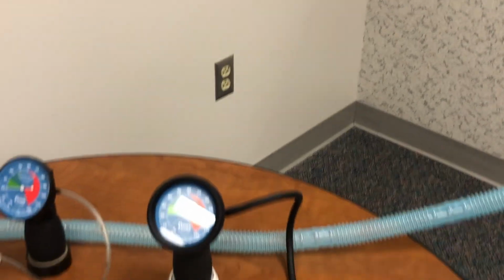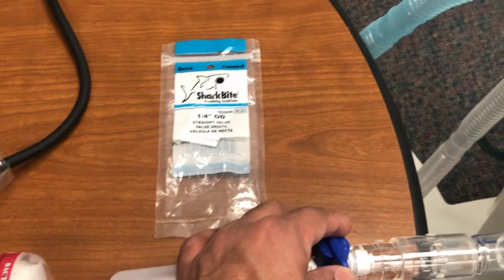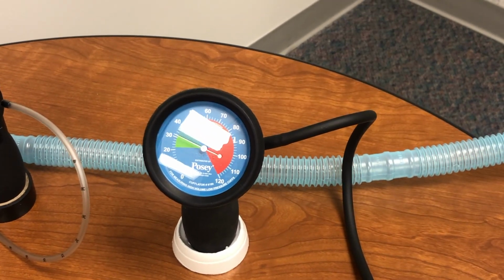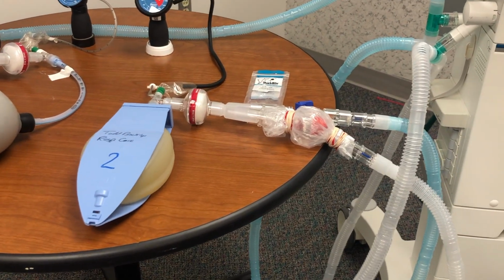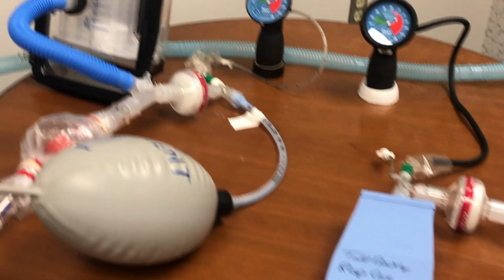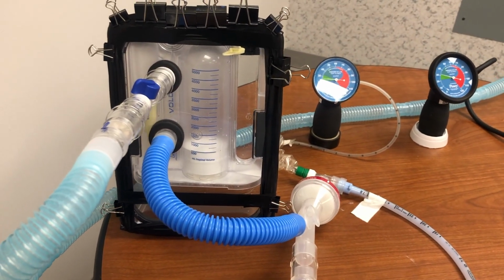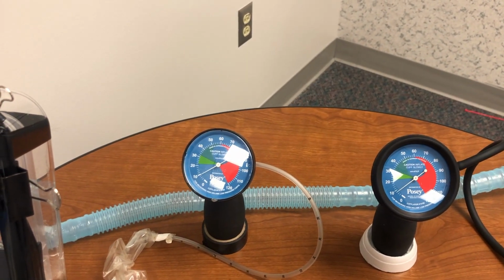Now, let's say this patient develops a leak or develops a pneumothorax. So I'm going to open it fully. So his pressures have changed dramatically, 30 to 40. Now let's see here, the volume has changed. This patient suddenly has either developed a leak or his lungs have become very compliant. Let's see what happened to our other patient, how much the volume changed. None at all. How much did the pressure change? Very similar.